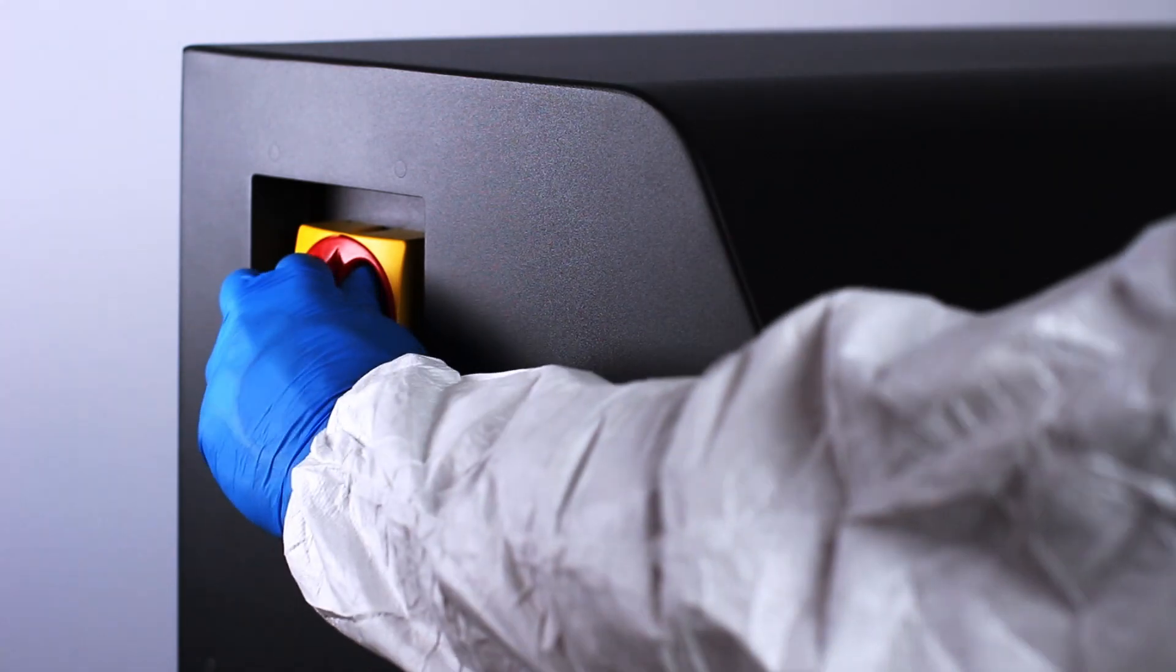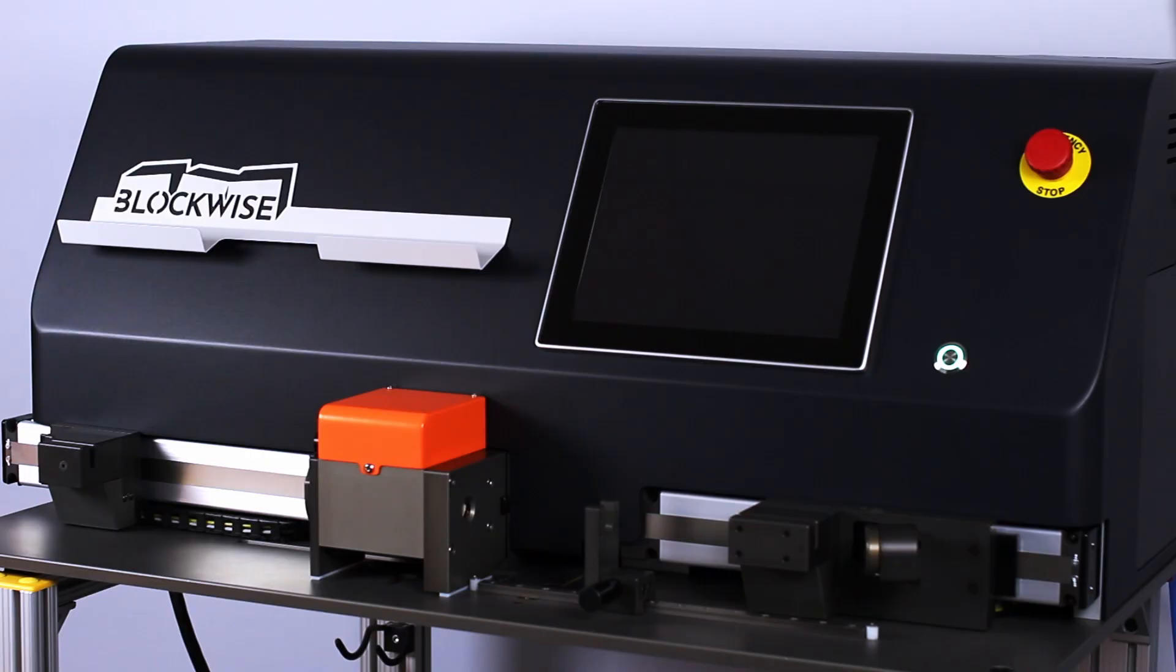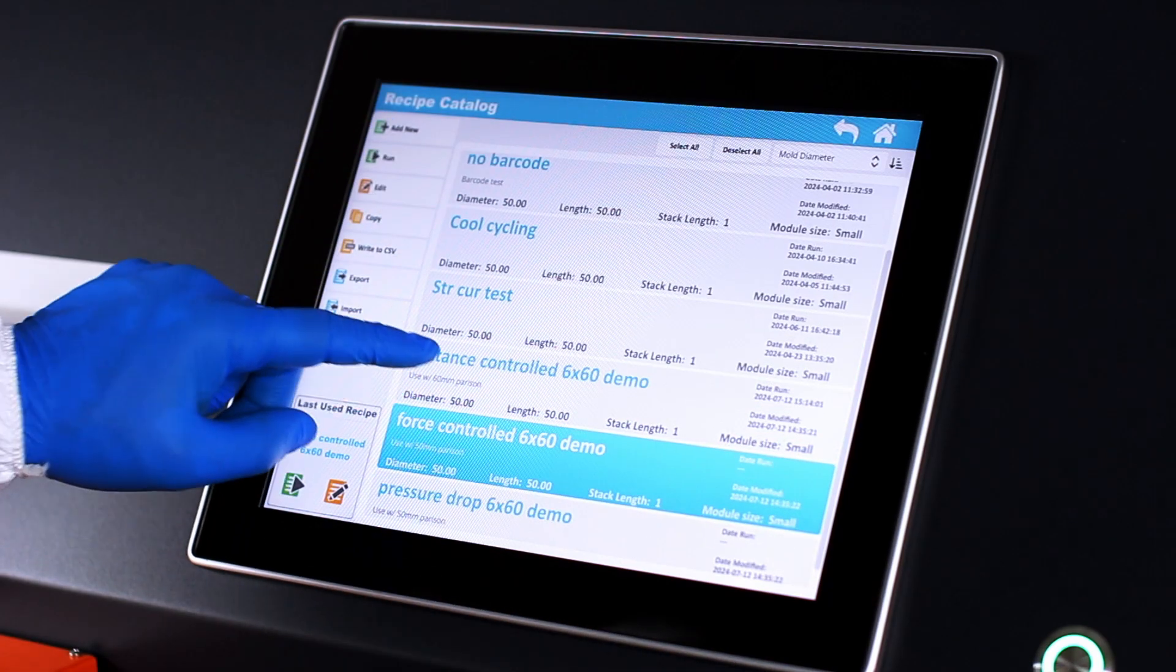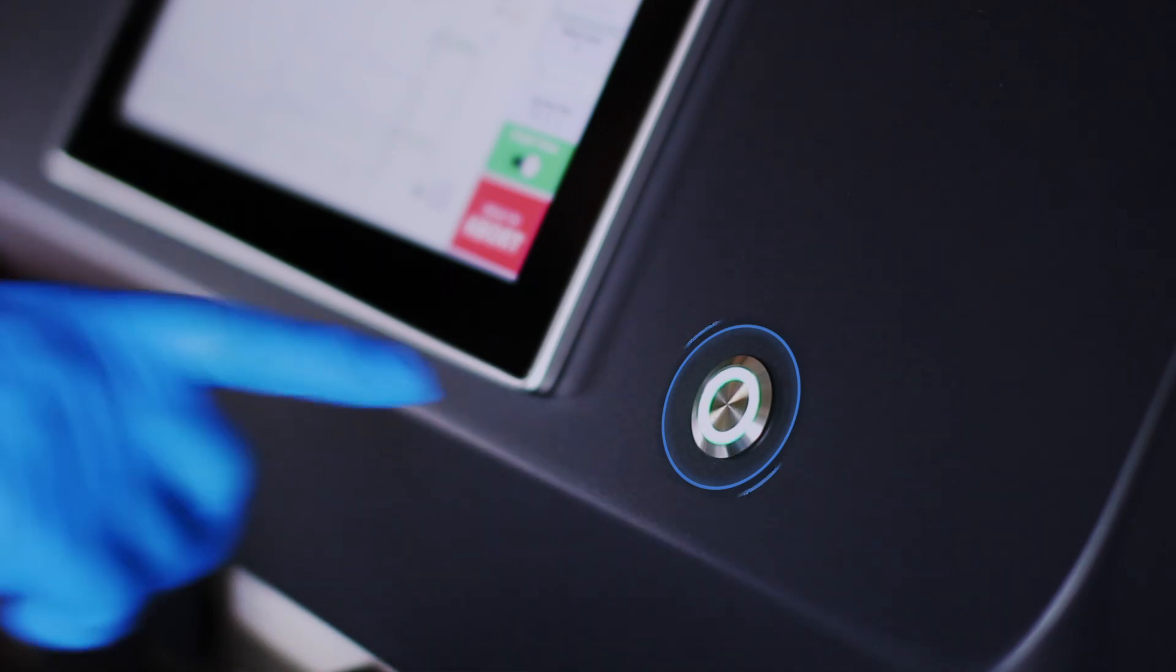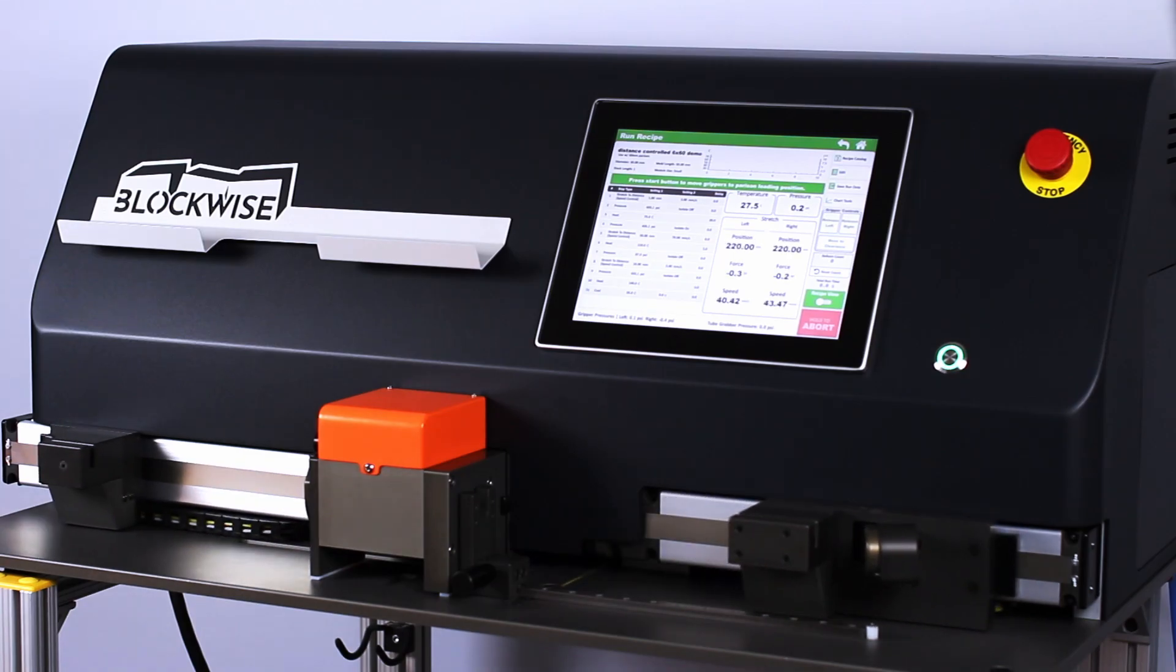With the tooling setup complete, the machine is ready to run a balloon forming cycle. Open the desired recipe on the run screen and press the start button to move the grippers into the loading position.